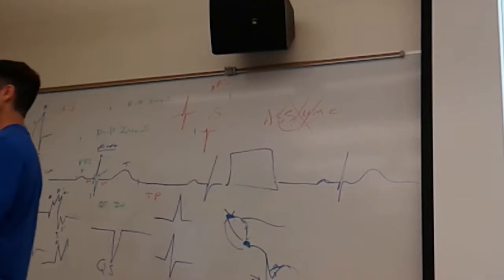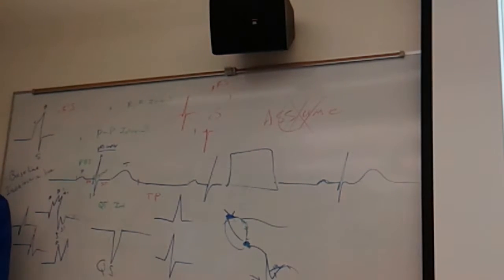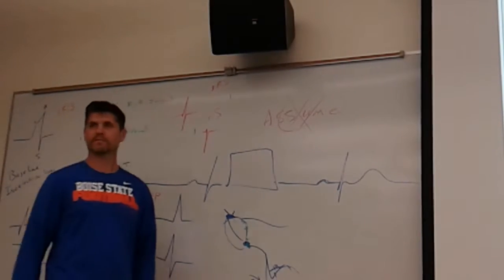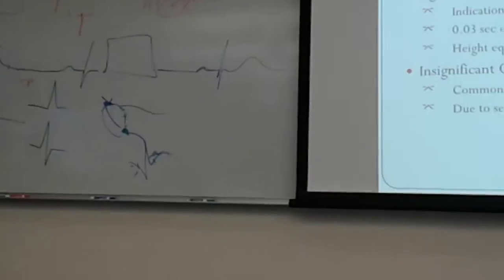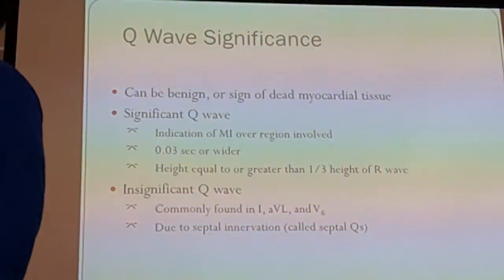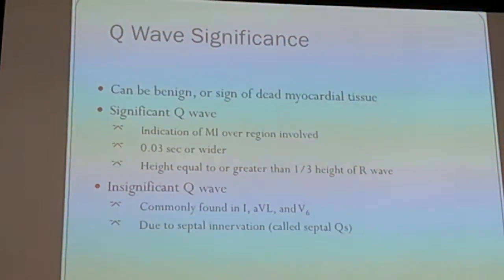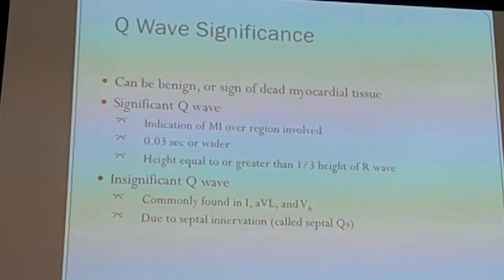And that's what you were saying with the QS versus an R wave. Yeah, it's just remembering what you're looking at. Yes, it depends on where you're looking. Okay. Awesome. Are we getting someplace? We're moving. The Q wave may not mean anything, or it may mean something very important. It may not mean anything, or it could be of critical importance.